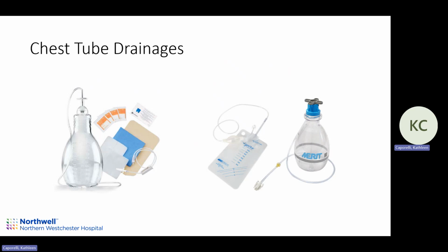And then typically the Pleurex itself is looped around a foam gauze. It's basically a drain sponge that goes around the tube. You wrap the tube around that, put another gauze on top of that, and a Tegaderm over that. So basically, you're just trying to prevent the tube from being in contact with the skin and causing erosion of the skin. And this is the one for the Aspira.